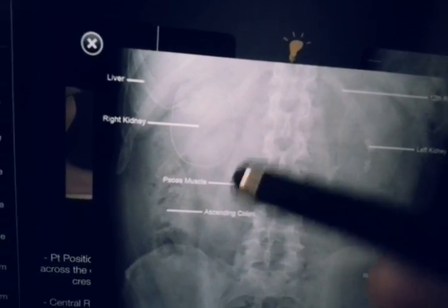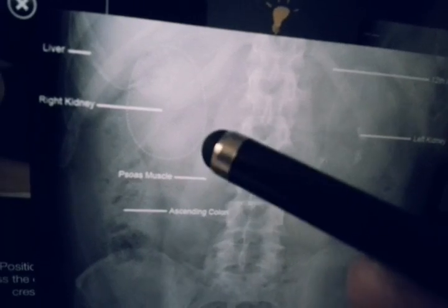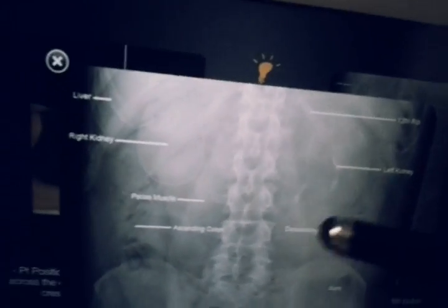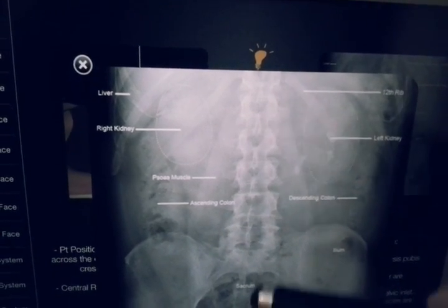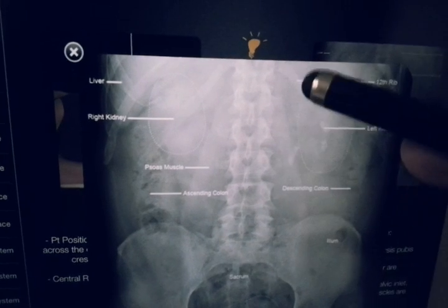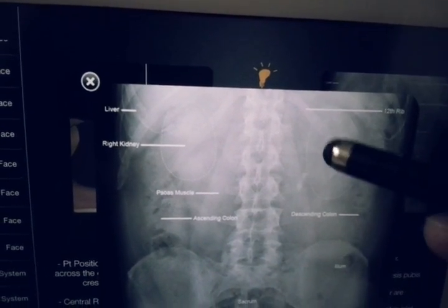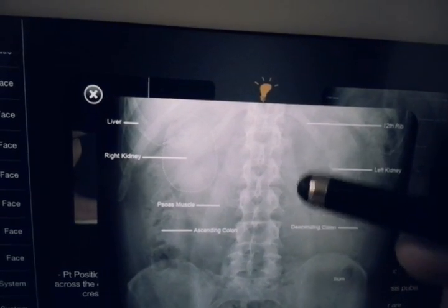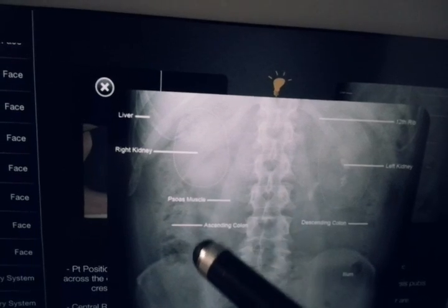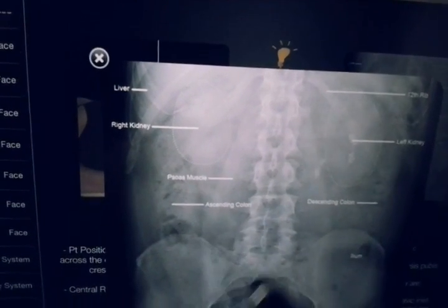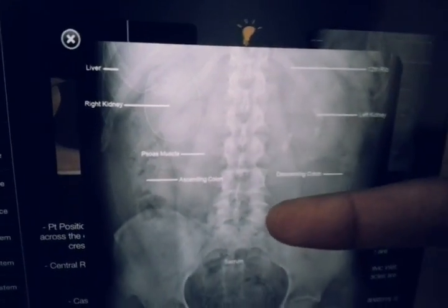We can appreciate the psoas muscle line shadow as a lucency on the X-ray film, as we saw in the anatomical diagram. The 12th rib ends here, attached to the last thoracic vertebra. We can count the lumbar vertebrae: L1, L2, L3, L4, L5. The left kidney spans between T12 and L3, while the right kidney's superior and inferior poles lie between T12 and the lower margin of L2. The ureters run downward and empty into the bladder.